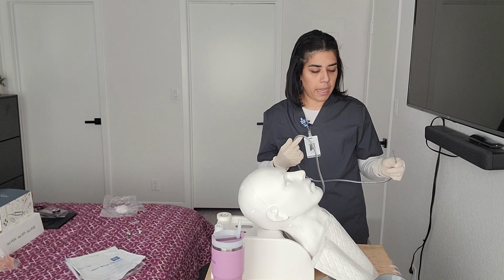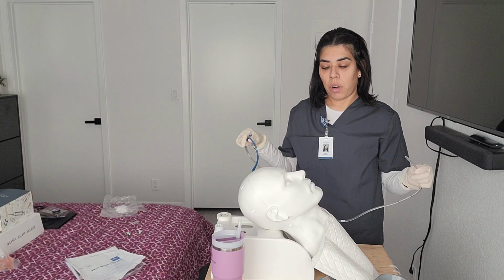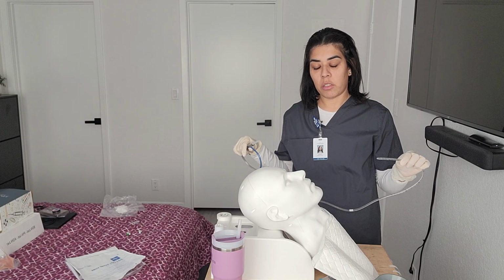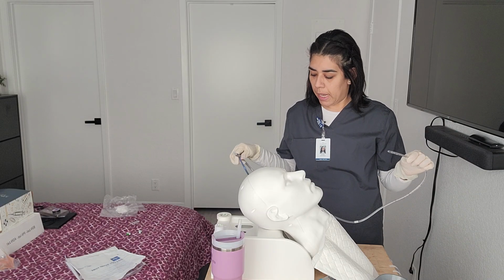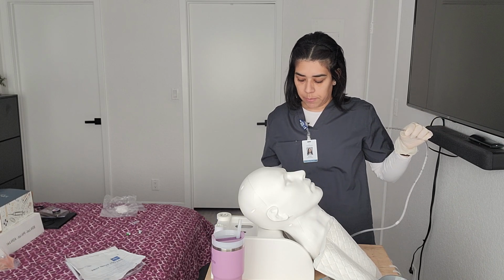We're gonna go ahead and start the insertion. So I'm gonna have you hyperextend your head. Once you feel the tube going down to the back of your throat, once your gag reflex starts kicking in, then I'm gonna have you lean your head forward and take sips of water, okay? All right, so patient understands the instructions.